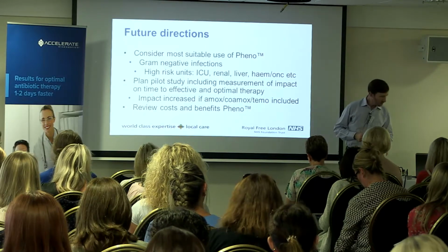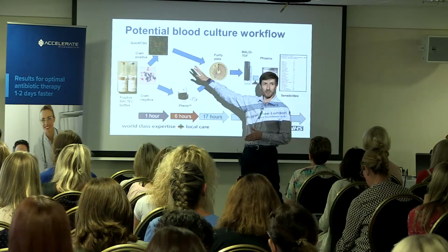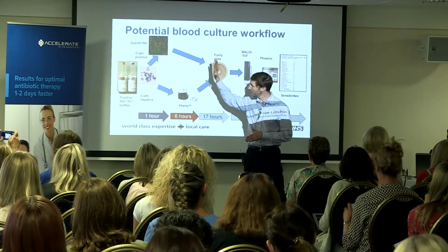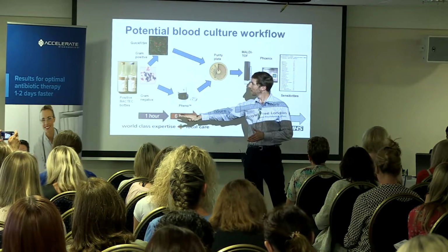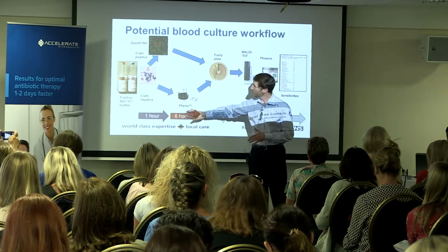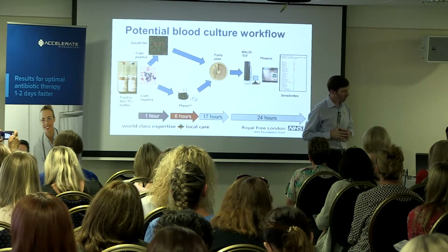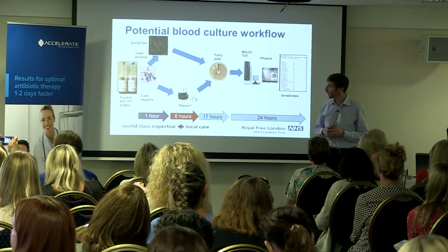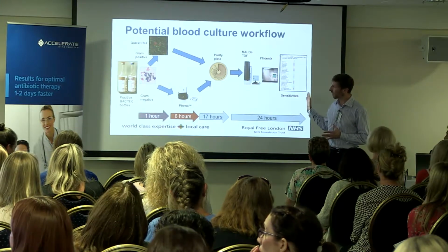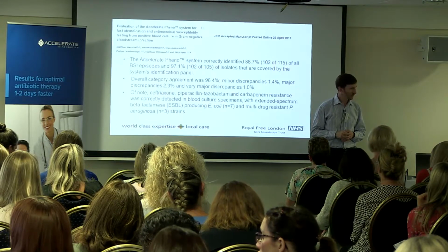And then finally, where we imagine this might shorten our gram-negative workflow. So we'll probably stick to QuickFISH for the gram-positives. We get the ID, we know what to treat the patient with. And for the gram-negatives, maybe Pheno system coming in here. So at about this point, we might then have a good idea about appropriate antibiotic therapy or targeted antibiotic therapy rather than further down the line here, although we'd probably keep going with our full panel, at least for the time being.